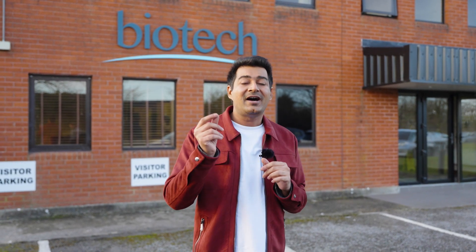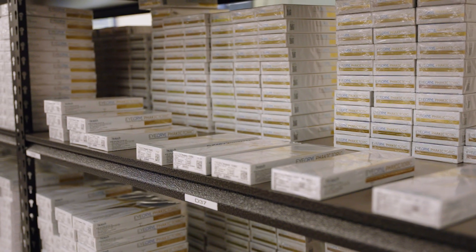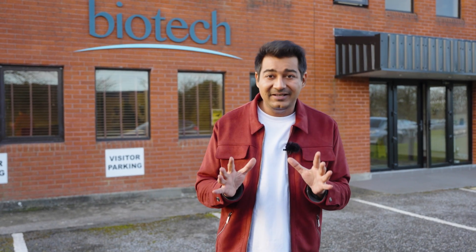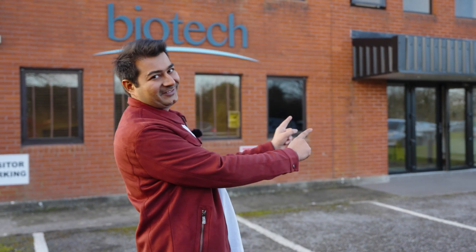I am going to show you how the lenses for the eye — the cataract lenses or phakic IOLs that we use for removing glasses — are manufactured. This facility is US FDA approved. I am also going to show you what kind of stringent protocols are followed to manufacture a quality product. So let's begin.